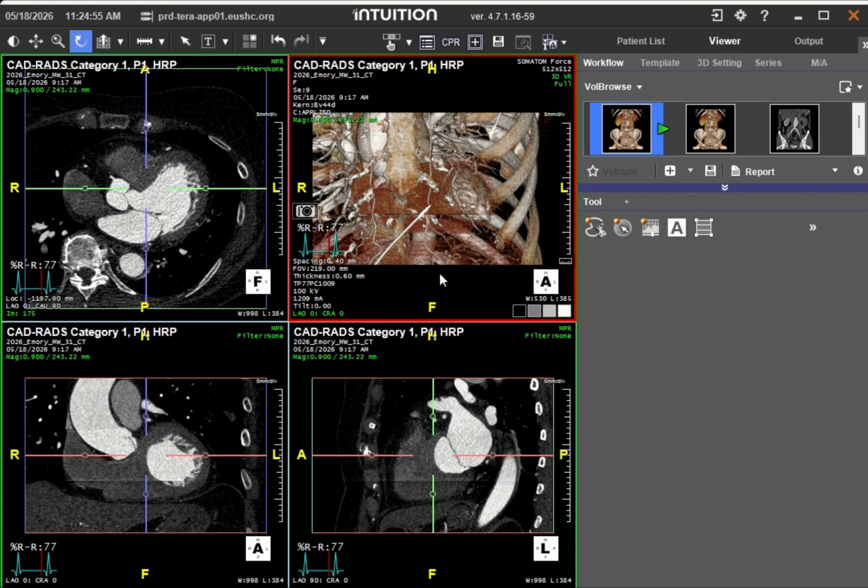I'm going to hand the microphone to Louise as I start working and doing Buttonology. He's just going to hold it up for me.